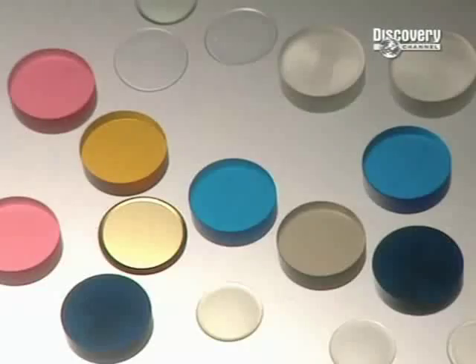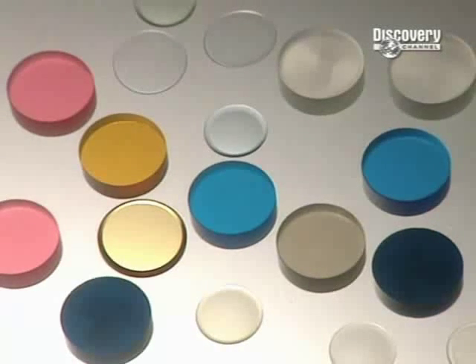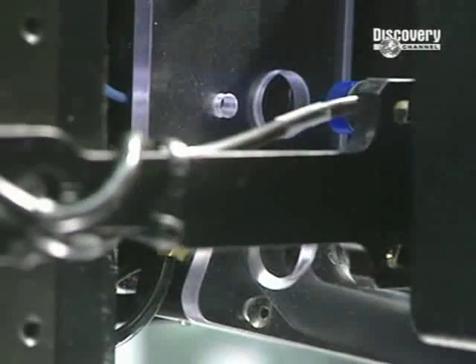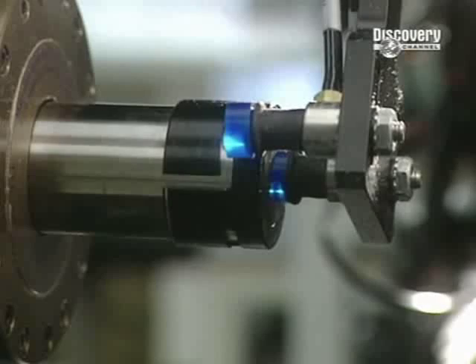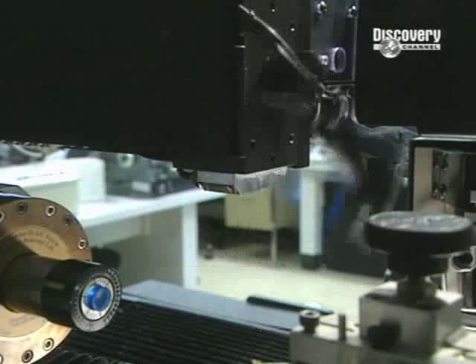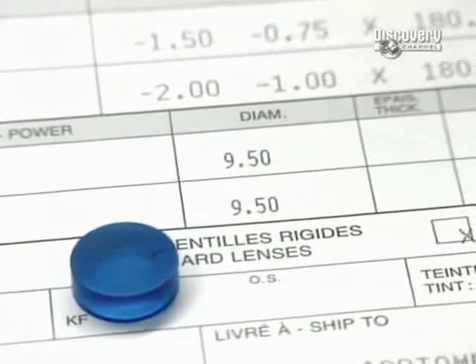Contact lenses have been in existence for over a century. At first completely rigid, they have become as flexible as gelatine. These small discs are used to make soft polymer contact lenses in a variety of colours. Of course the place to start is with a patient's prescription, which has been digitised for the process to begin.